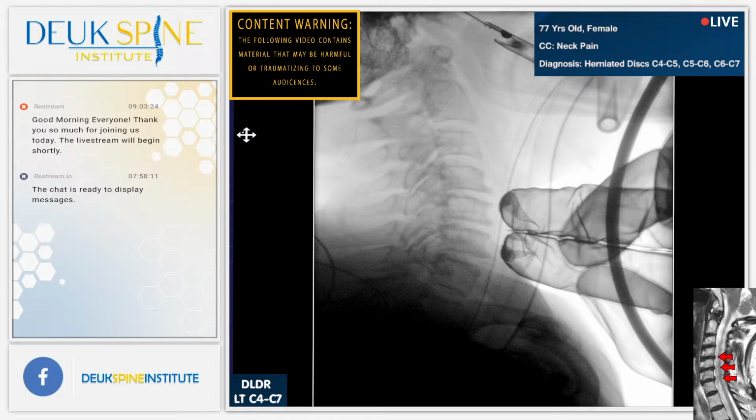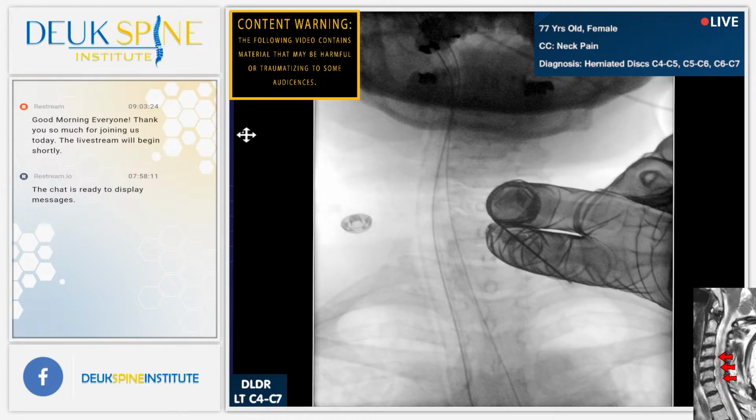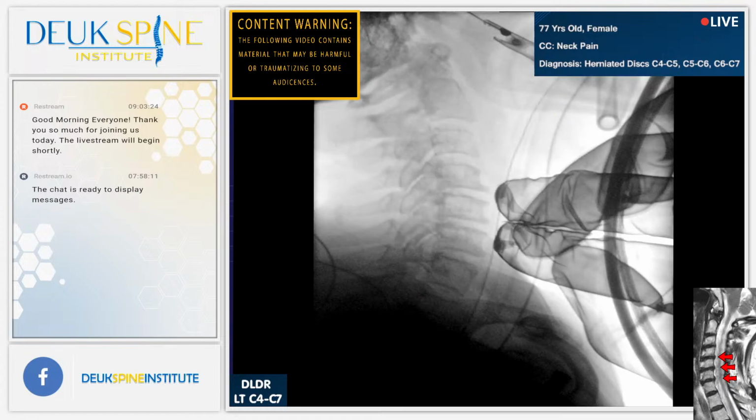I want to make sure I'm in the midline. I can feel the spine with my fingertips, by the way, in case you're wondering. I'm literally touching her spine. Perfect. So we're almost exactly in the center. Are we broadcasting? Of course. All right, excellent. So you can see that on that picture also I displaced the trachea and esophagus.